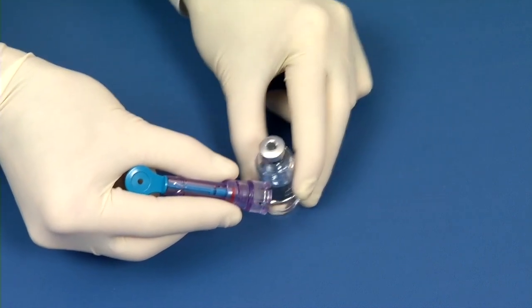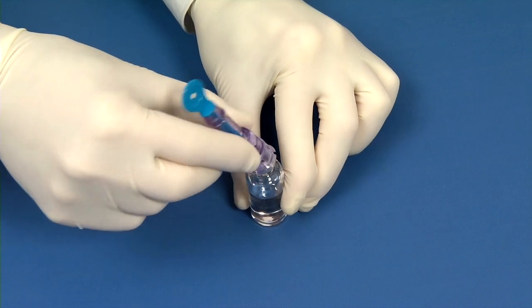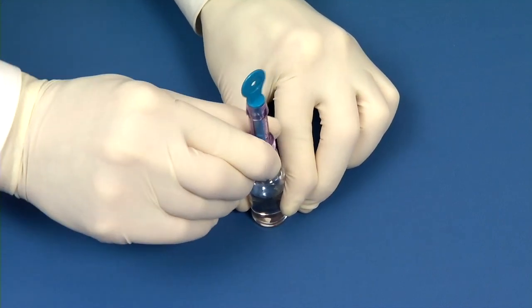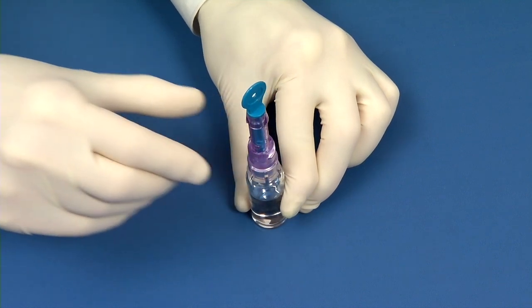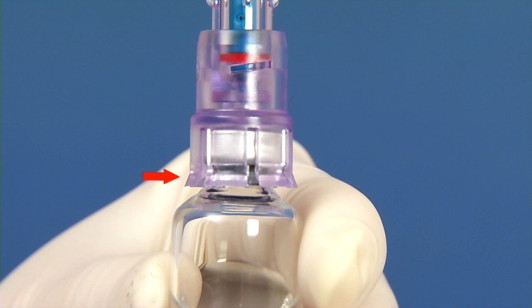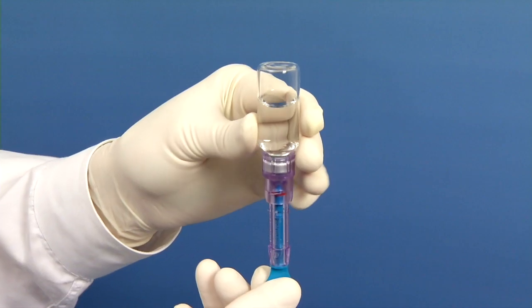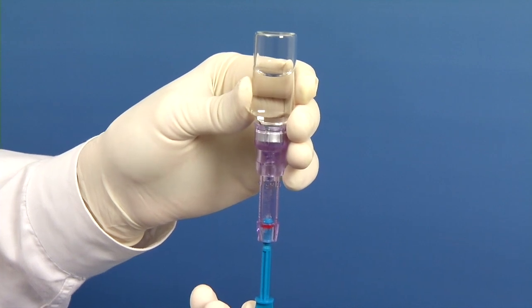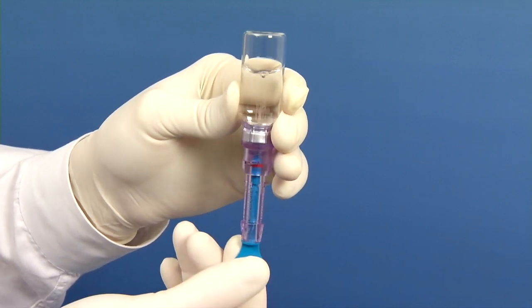Being careful not to touch the spike, align it into the center of the vial rubber stopper. Next, with a downward twisting motion, insert the vial adapter into the vial until it is fully seated. Ensure the holes in the vial adapter spike are below the vial stopper. Use standard procedures for pressurizing the vial prior to drawing the fluid if necessary. Do not attempt to use a partially filled syringe.